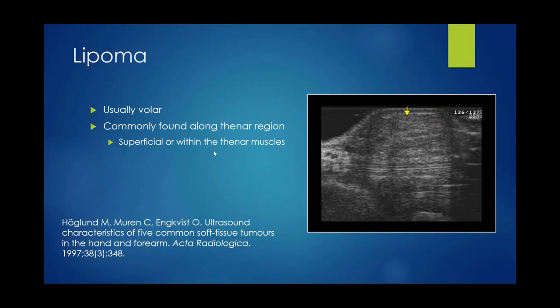Which direction do you ultrasound when evaluating for a possible glomus tumor? I showed mostly one projection for evaluating structures, as some structures are more amenable to interrogating in their short axis. Some are more easily seen in their long axis. So you would look at it in both axes. To me, the nail bed would make most sense if it was initially interrogated in its long axis. If I saw an abnormality, I would then also image it in its short axis, or cross section.